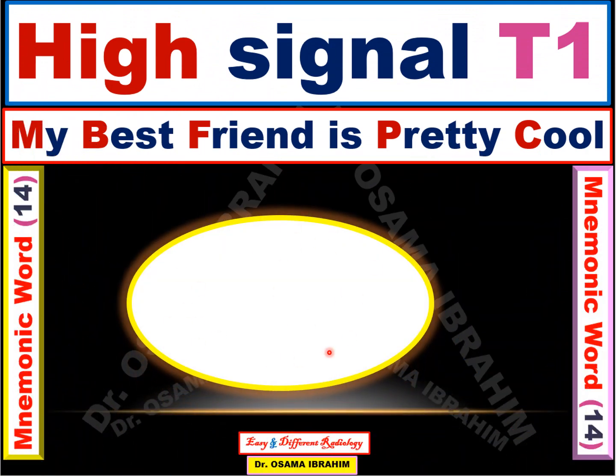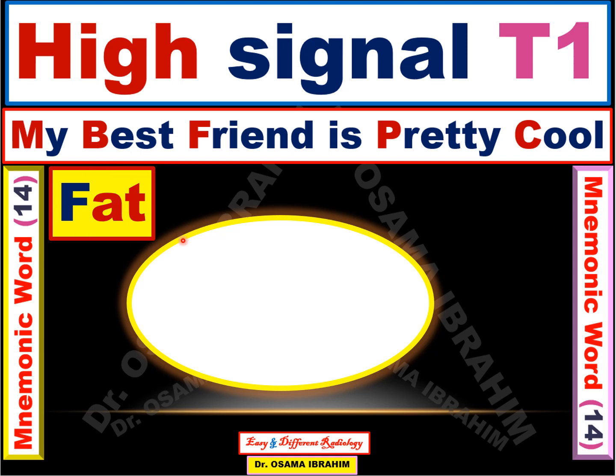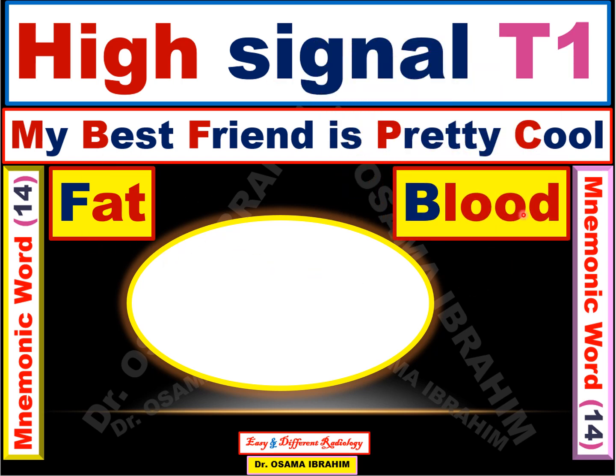Again, this diagram represents My best friend is pretty cool, or high signal in T1. If I present it as a case with high signal in T1, the first thing that comes to my mind is fat, and the other thing to think of is blood. Fat and blood come at the top of the differential diagnosis without remembering any other causes, and then according to the history of the patient and other imaging findings, we can consider the other differential diagnoses. However, fat and blood come on top of the differential diagnosis of high signal in T1.